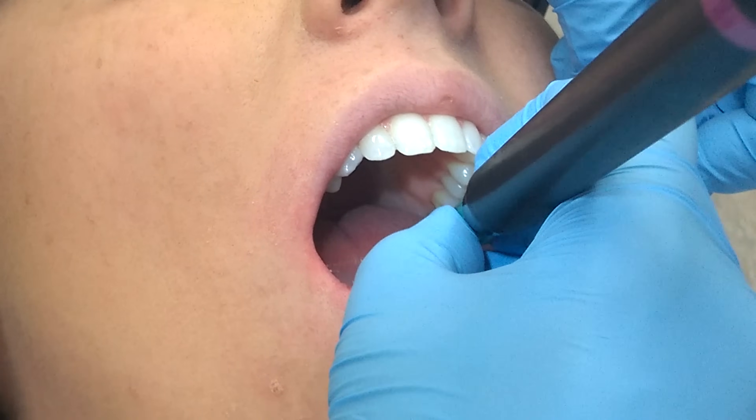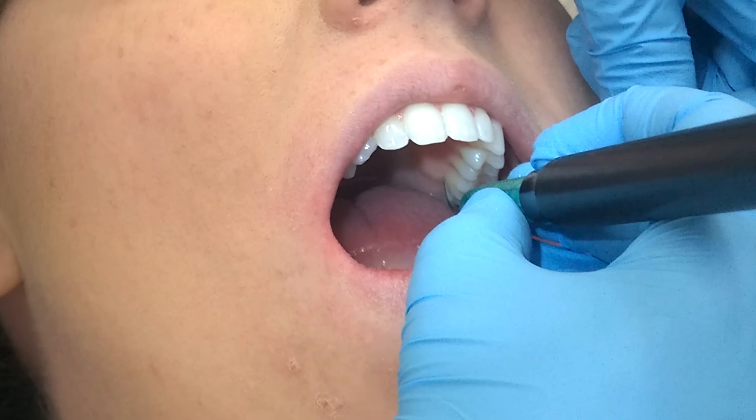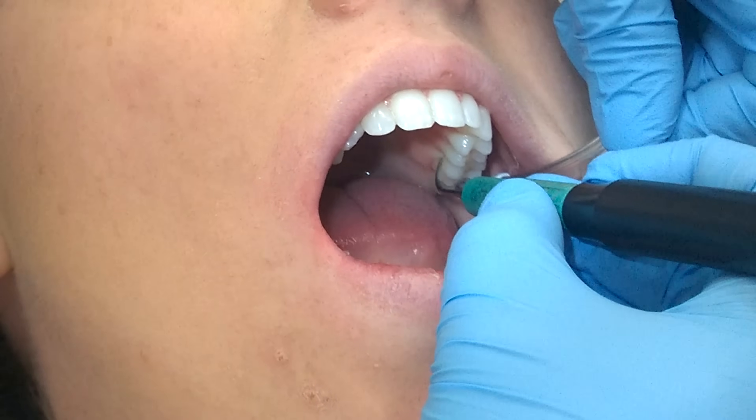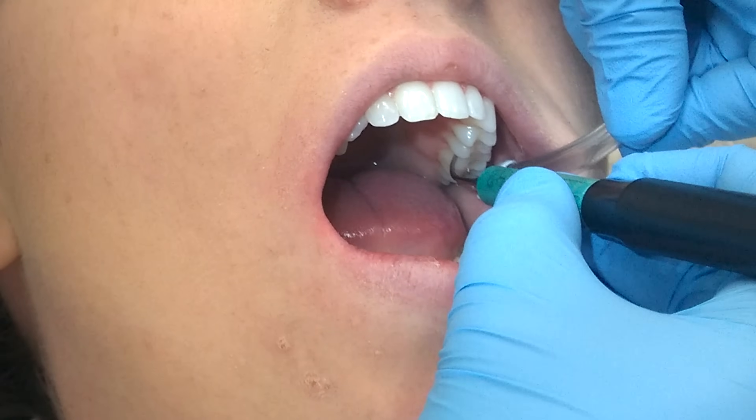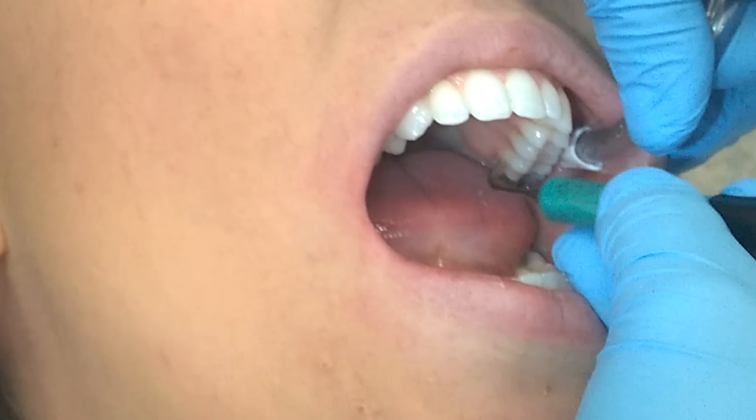Make sure that you also have a light grasp when you're using the ultrasonic, because if you have strong lateral pressure against the tooth it actually makes the ultrasonic less effective. So use a light, exploratory-like stroke as you're using it.